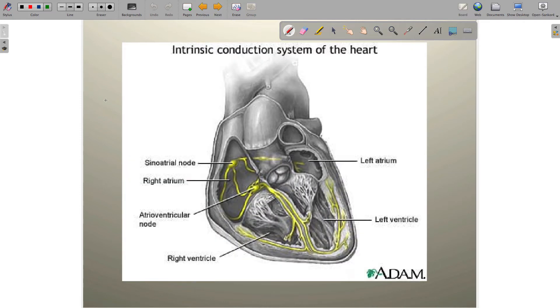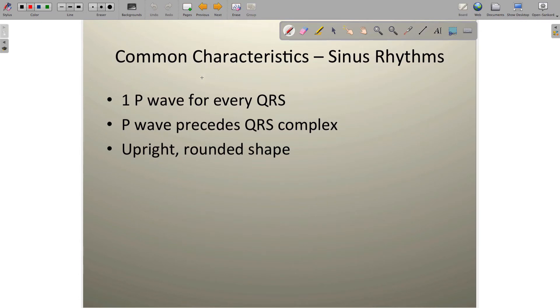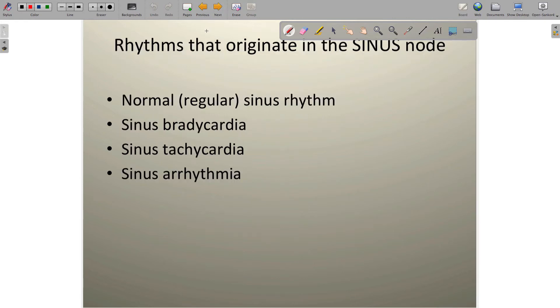In order for us to call something a sinus rhythm, it's got to start right here in the SA node. Anything we call a sinus rhythm is going to have some common characteristics because if the impulse originates from the same place every time, it's going to travel down and create a very specific pattern on the EKG. These common characteristics are: one P wave and only one P wave for every QRS complex, the P wave must precede the QRS complex, and it'll have a nice upright and rounded shape.